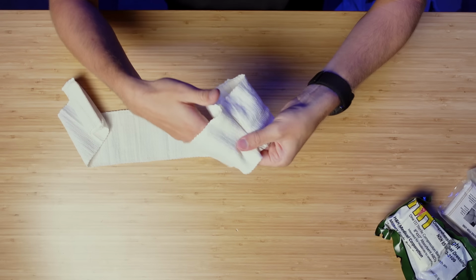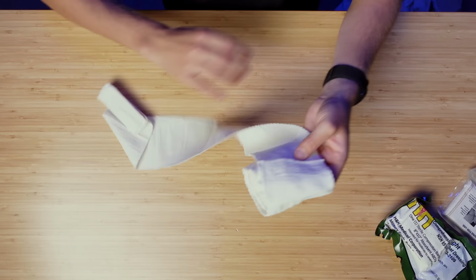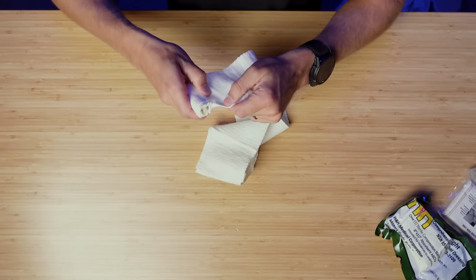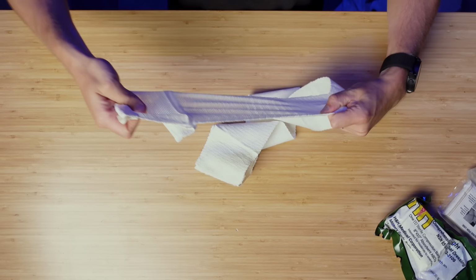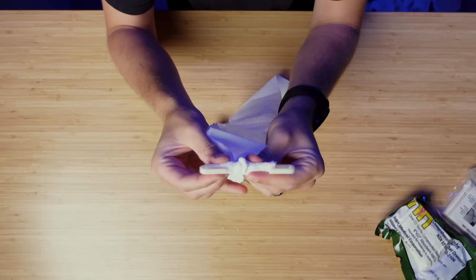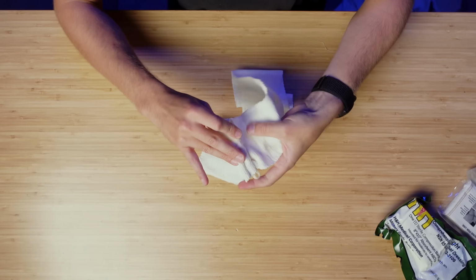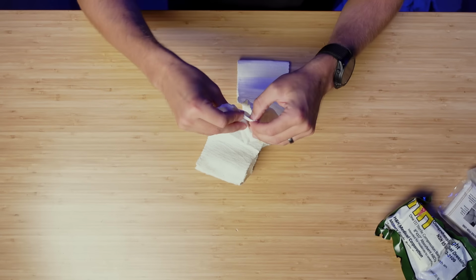This is going to stick to the Velcro, and that's going to keep you from just pulling it off their leg when you try to tighten it. These, you're going to be tightening very, very tight. Now up here we have the little bracket and a piece of Velcro. So it's going to Velcro down, and then we can take the rest and feed this back through this clip and keep it secure on the patient. Very important to keep it secure on the patient. Just know, when you wrap a couple times, you get more friction.